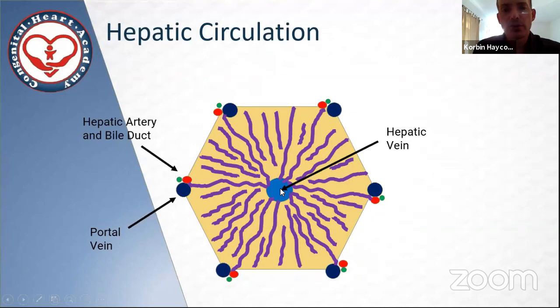When we run into situations where there is high venous congestion, the pressures are transmitted back up into the sinusoids, and normally these can dampen the venous pulsations that are there in the hepatic vein, and the portal vein as well will dampen it by nature of its high compliance. However, when the congestion gets bad enough, we lose the dampening ability because they're stretched to the max, and then we can get some of these hepatic pulsations detected in the portal vein.